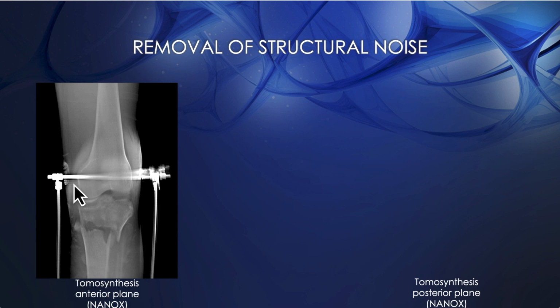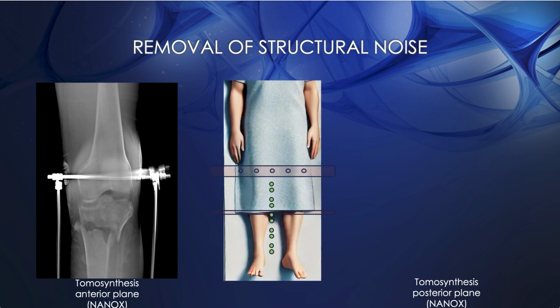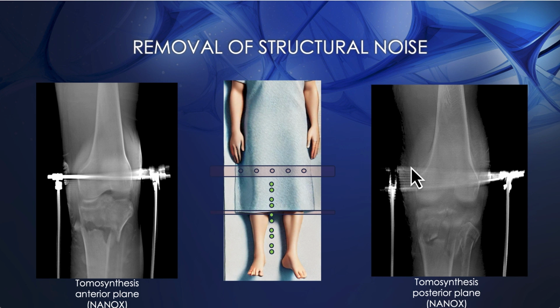Now, metal is essentially impervious to the radiograph. You see no detail behind it whatsoever. But with tomosynthesis, this is not as much a problem. So focus here on this metal. Right now, we are focused in the plane of this rod. If we move the focal plane to behind the rod using a linear pattern of acquisition, this rod, being out of plane, will be blurred in the pattern of the different projections that are acquired. And that's what's happening here. That's why you see the rod does not look as dense. It repeats in this cranial-caudal direction. And the benefit of all of this is that you can now see the anatomy behind it.